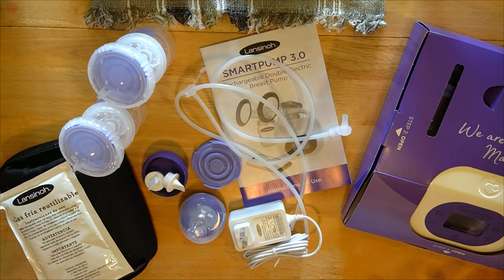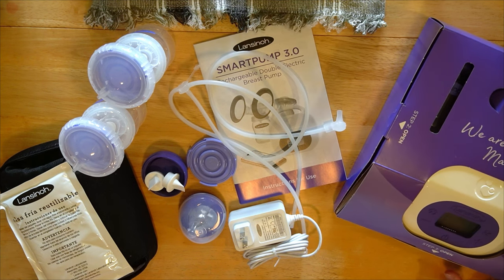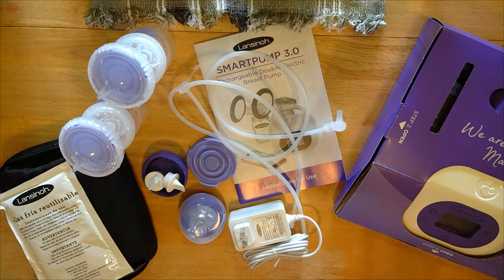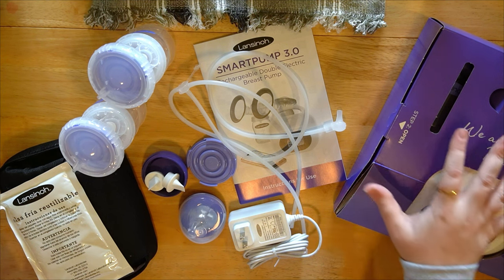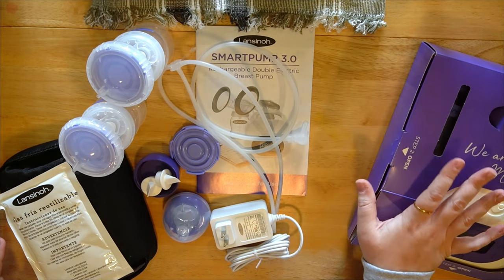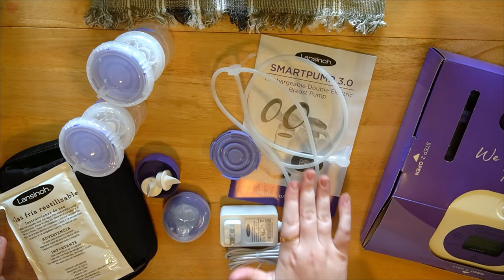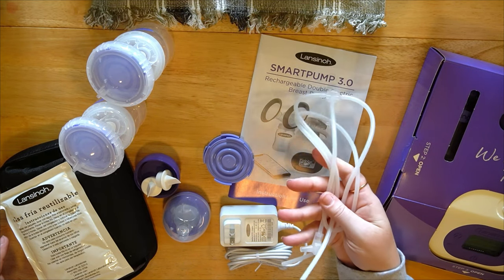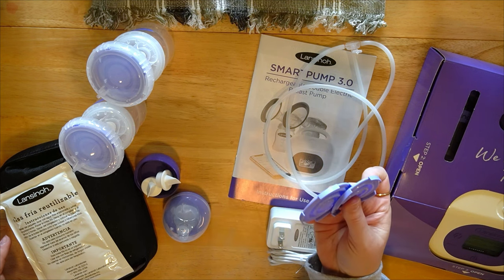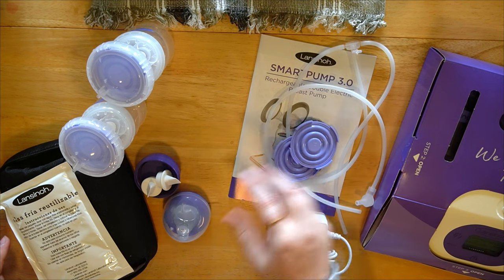This is everything that came in the box. I purchased mine from Walmart so it might look different if you had an insurance pump — just keep that in mind. This was the first box right on top — we'll open that up in just a second. You also have your user manual, the tubing, the wall adapter, and two extra diaphragms, which is really nice.